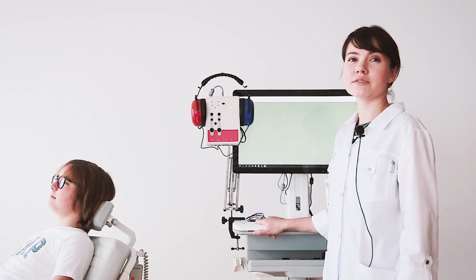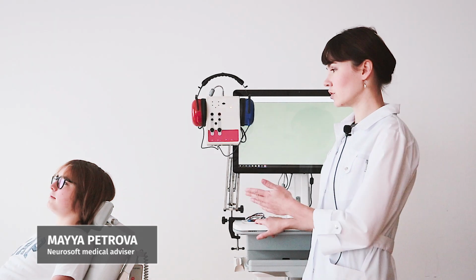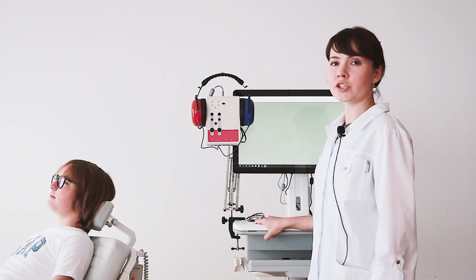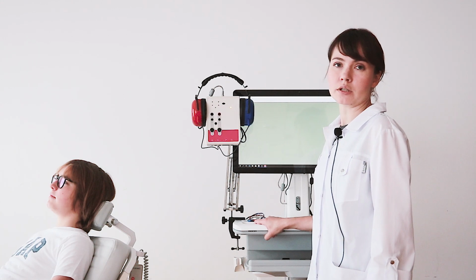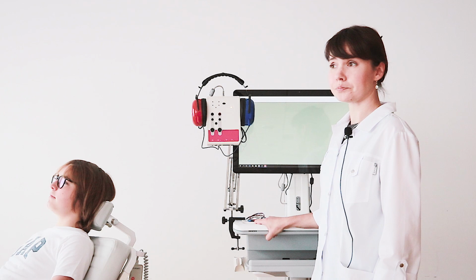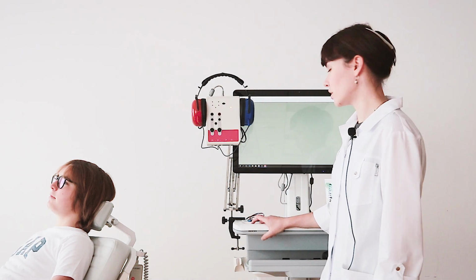Now let's continue with the auditory brainstem responses. Before performing this test, we need to check if our patient is fully relaxed, especially his neck and face muscles. If your patient is a child, it will be better if he or she sleeps during the procedure. And our room must be well soundproofed and have good grounding for this test.